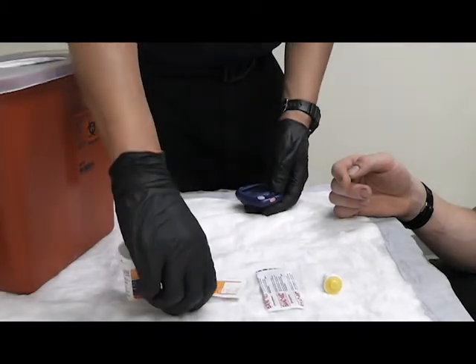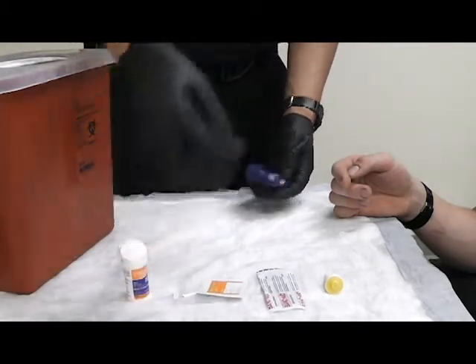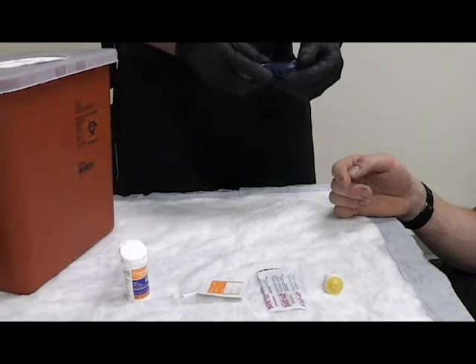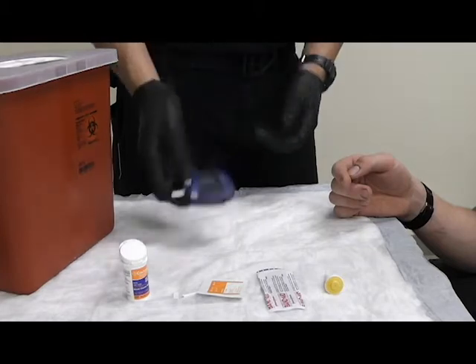I'm going to first start by inserting my test strip into my glucometer to make sure it's functioning properly. Test strip is functioning properly.